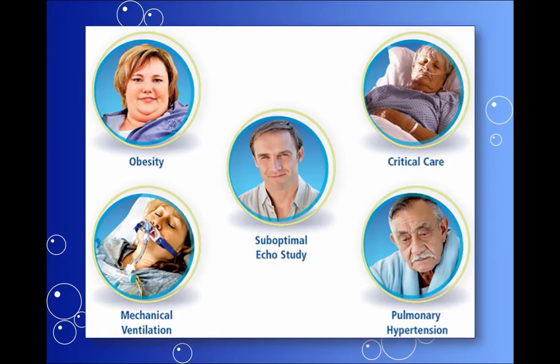It is used for suboptimal echoes to improve visualization of the heart. And people that potentially could have suboptimal echoes are critically ill patients, intubated patients, or obese patients, to name a few. The echo tech is going to let you know that they have the suboptimal echo, and then they're going to ask you to help prepare the Definity for that patient.